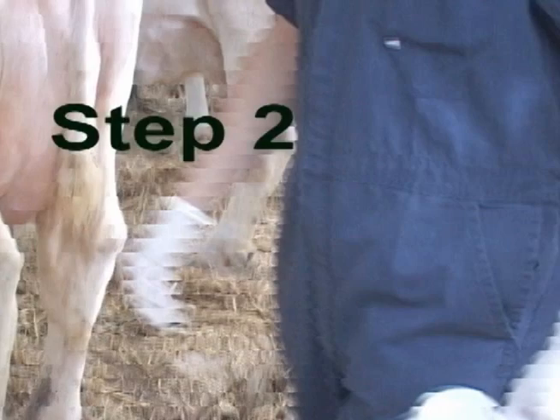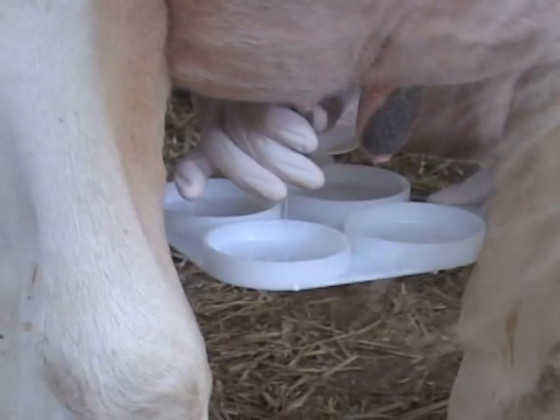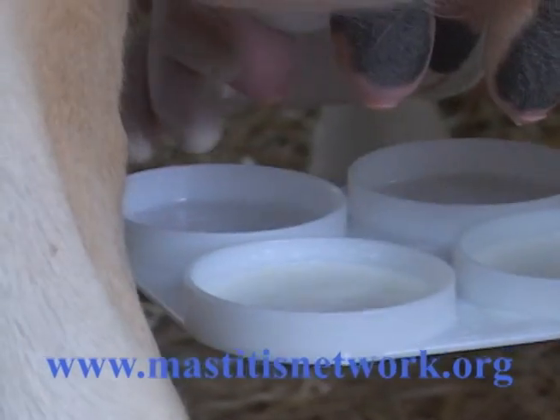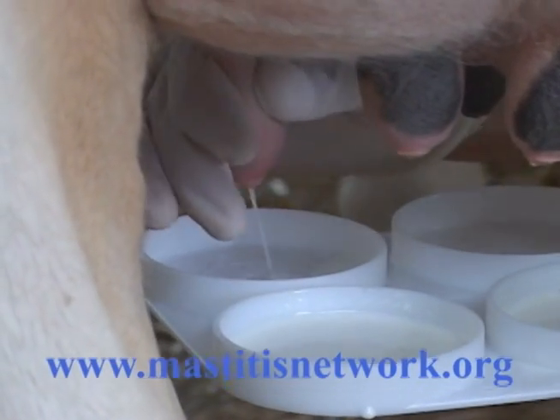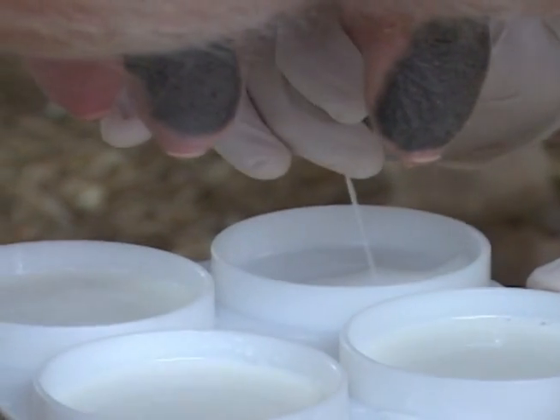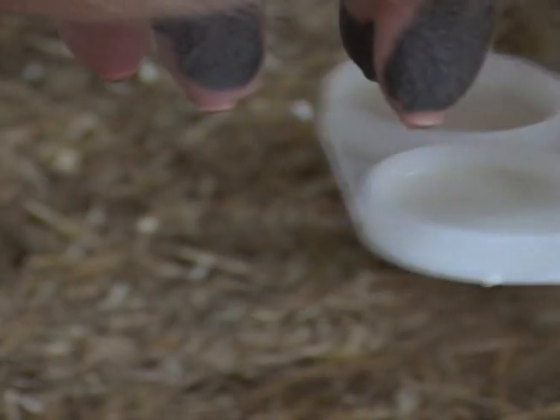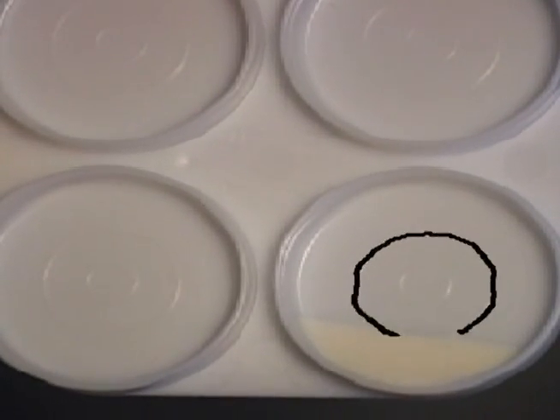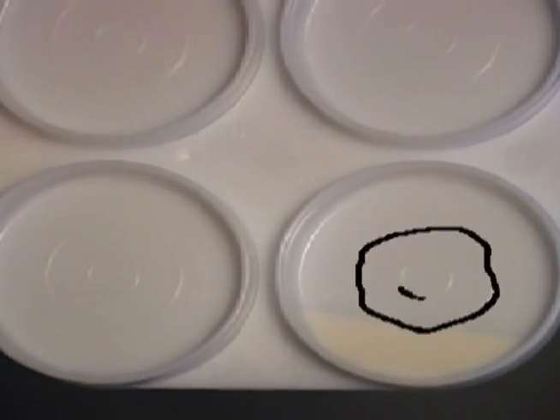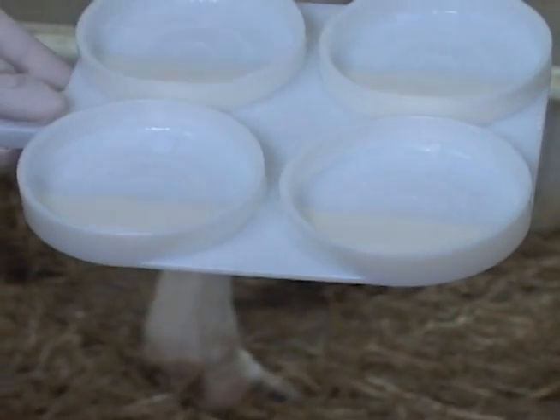In step 2, always use the same paddle position from cow to cow, always on the same side of the animal, right or left. This will make it much easier to keep track of quarters when interpreting results. Collect milk from each quarter into the respective paddle cup, covering the bottom of each cup. If you look carefully, you will see that there are 2 circles in the bottom of each cup. These circles indicate the amount of milk and reagent that needs to be added for the test.